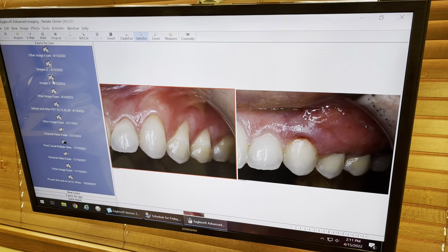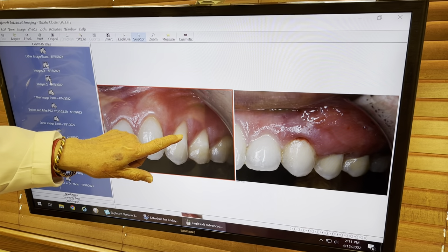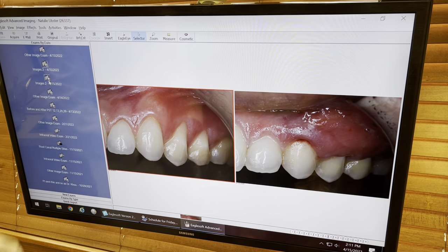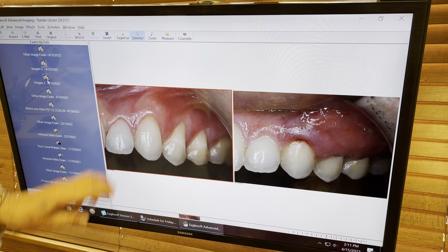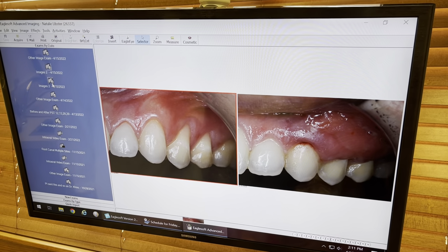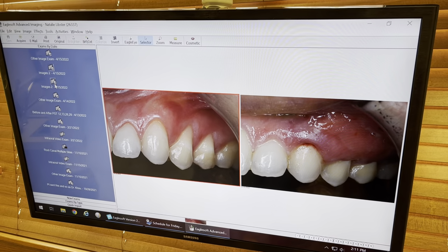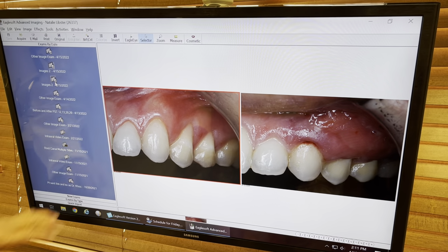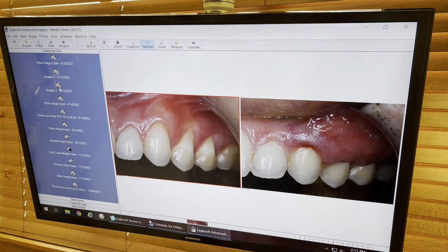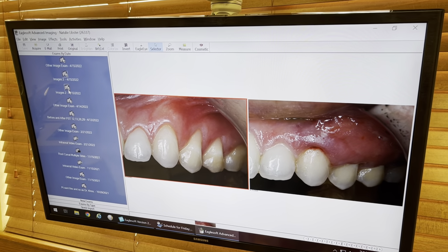This is what we did. We have exaggerated recession here — about four millimeters and about three millimeters here. We put pinholes and used our instrumentation on camera live, and we finished this entire procedure from here to here in 12 minutes. Now let's go to the lower right quadrant and show you what we did.